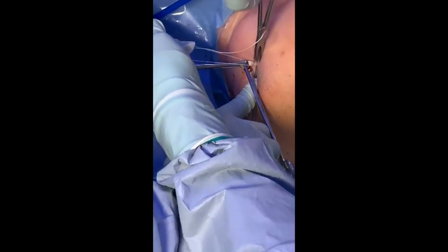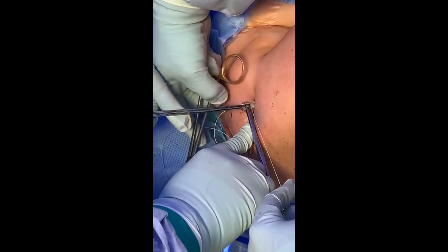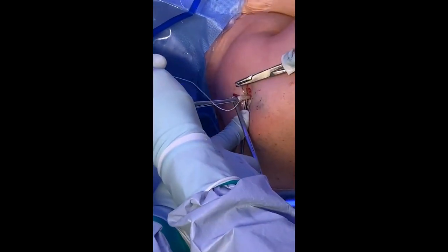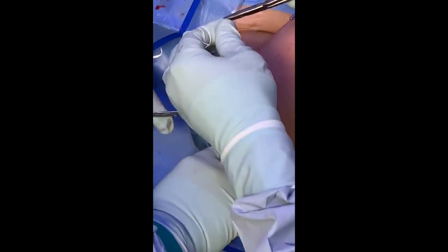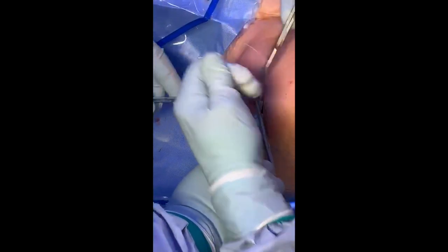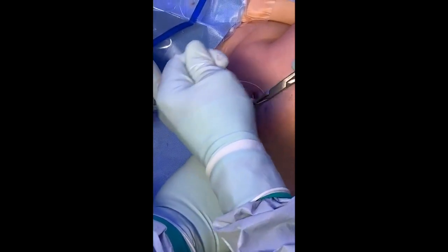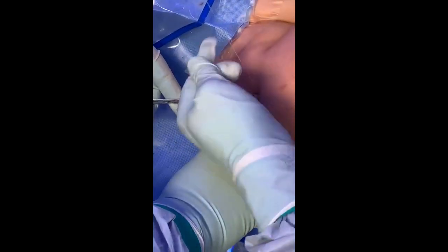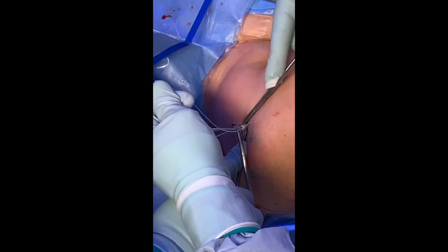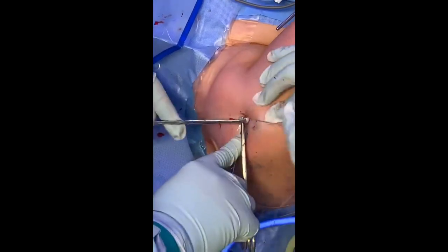I'd advise you when first starting this technique to take the arm out of traction. This arm is in traction because I have a skilled PA who is good at delivering the bicep for me. But as you're learning this, do yourself a favor — take the arm out of traction. You'll find you can get incredible excursion out of that bicep tendon percutaneously if you do that extensile release of the transverse humeral ligament. Cynics say you're not able to visualize distal enough in the bicep groove with an arthroscopic technique versus open sub-pec. But without traction and with a good release, I can easily get five centimeters of visualization in the bicep tendon, and in older patients with degenerative partial tearing extending down the groove, I can easily perform debridement or extended whip stitching further down the bicep groove.